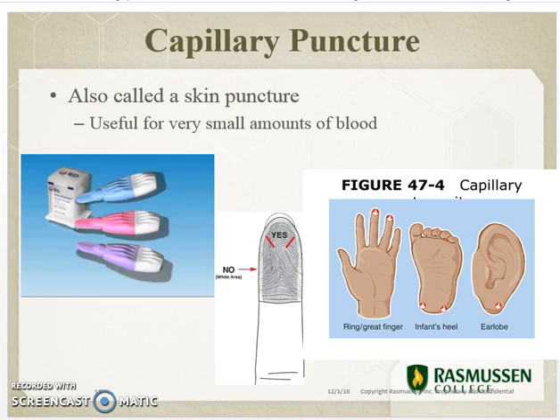We can also use the earlobe as another option, but typically you stick with just the fingers. You'll need to use a lancet, which is a device that contains a needle inside of it. And the recommended depth for adults for this puncture is 2 millimeters.